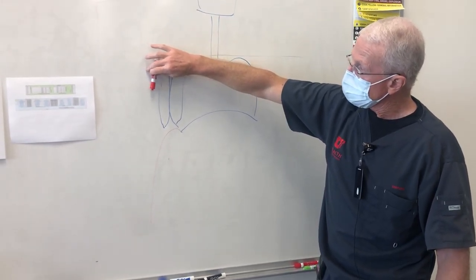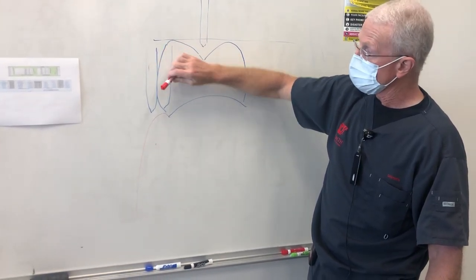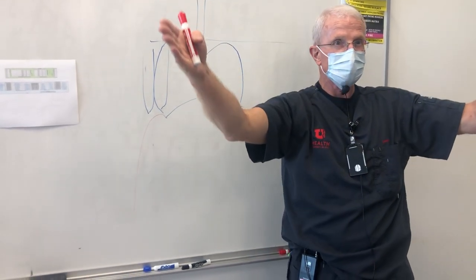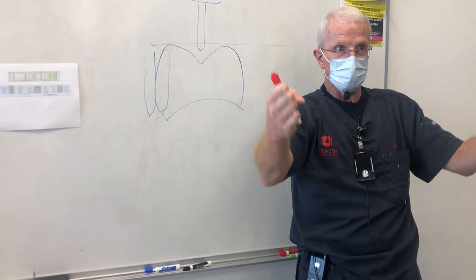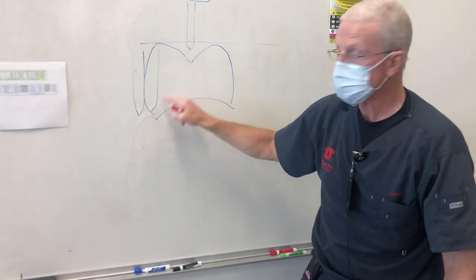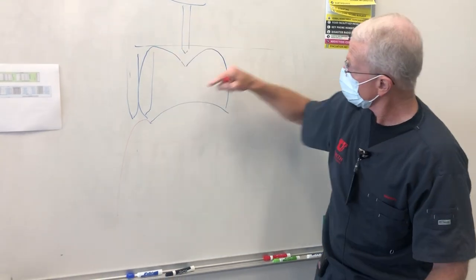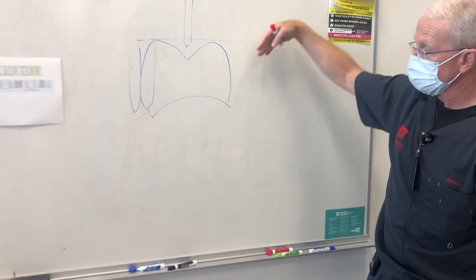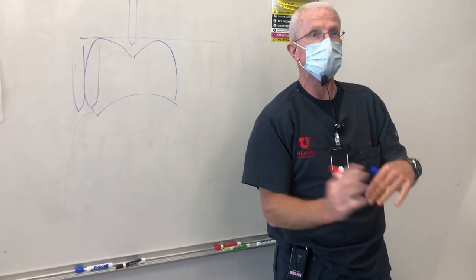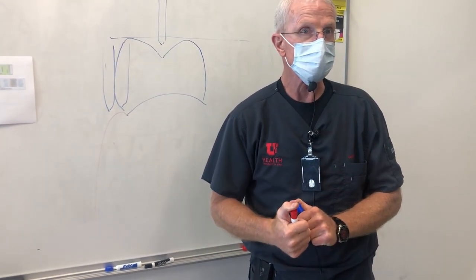So you're going to come in close to depth and then down a little bit, gingival. As you do that, your axial depth will drop off a little bit because, remember, the tooth is kind of coming into itself. It's tapering inward. So the more apical or gingival you go, the shallower your chamfer will get. Does that make sense to everybody? Can you see that? Because of the contour of the tooth, the tooth is belled out, and as you go gingival, you're cutting the chamfer off, and so the chamfer depth decreases. So give yourself enough tooth structure to finish that out. Is everybody clear on that?